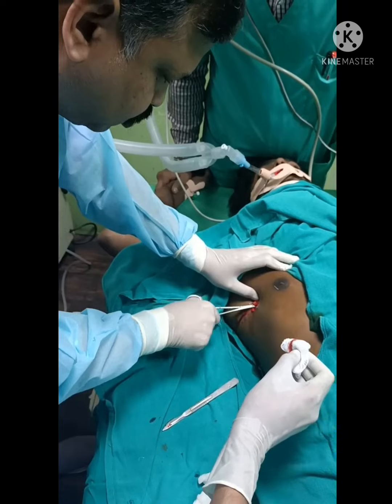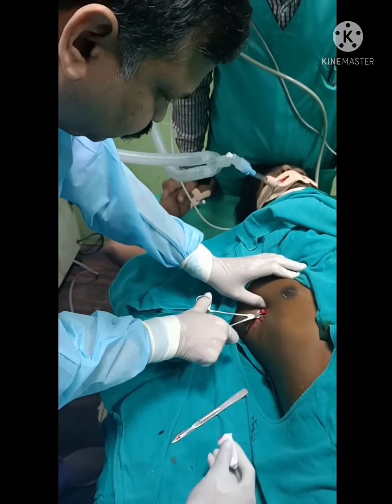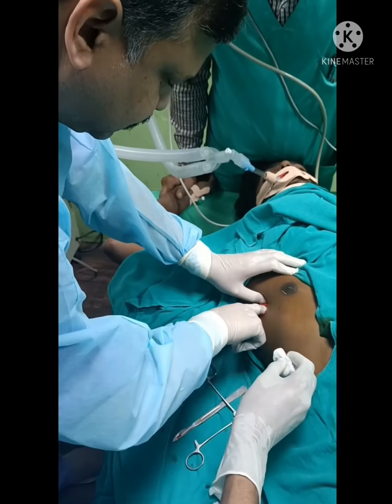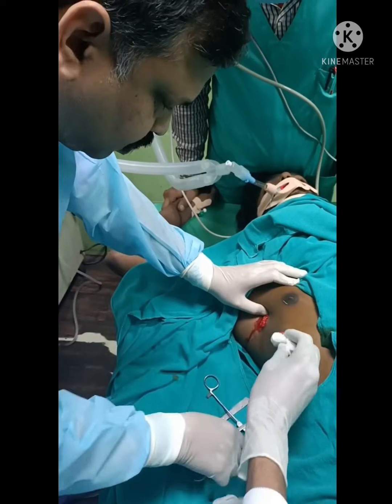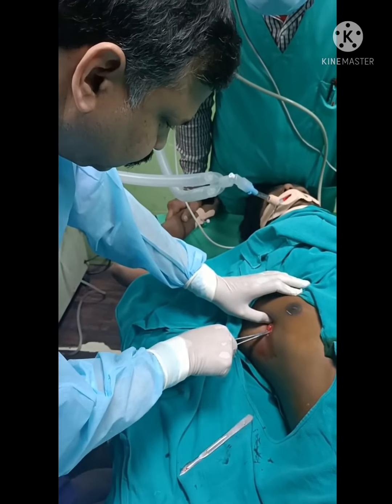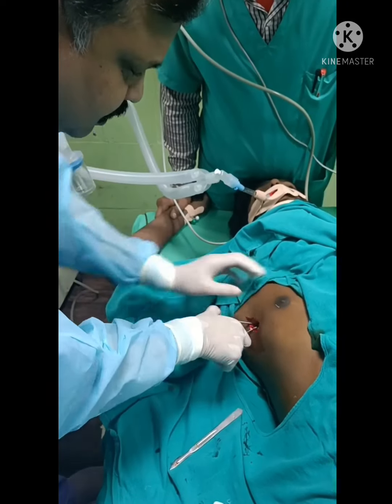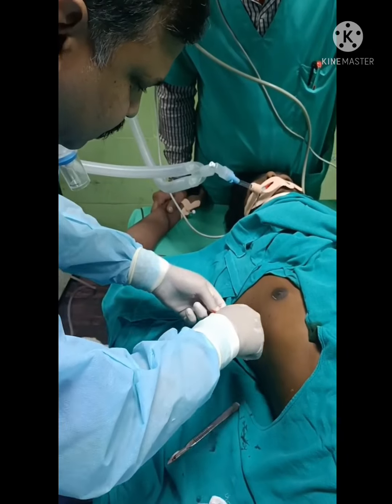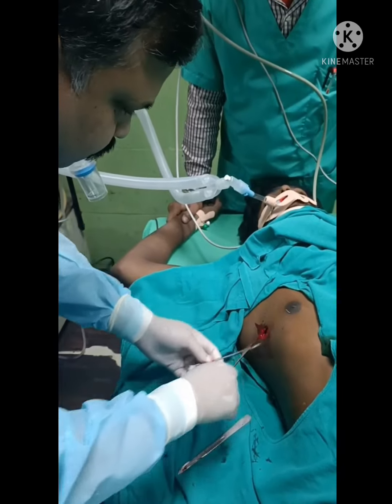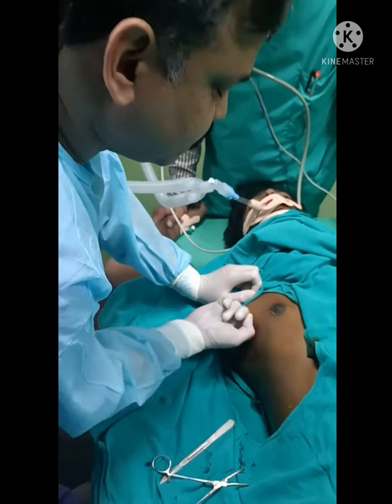If somebody can show me, dissect and dilate again. You can feel, I can feel the ribs. Yes. So I have to go to the upper border of the lower rib. So when you get that, give a feeling, open the clamp, and then in the open state, bring the clamp out. Since this patient is lying down, we might not get immediate blood.